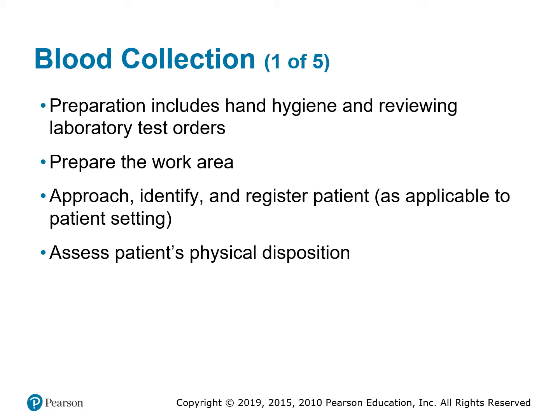So if we are working in a hospital or inpatient service as a phlebotomist, the first thing we do when we clock onto the clock is we make sure that our equipment tray is ready to use for phlebotomy draws. So basically, when we prep our phlebotomy tray, which is the tray we hold all our equipment that is needed to do a lab or venipuncture procedure, we first and foremost have to make sure that it is cleaned out and fully stocked, that it has every appropriate tube, needle, syringe, alcohol, gauze, band-aids, tape, anything and everything we could possibly need to service the patients to the fullest and most effective means possible.